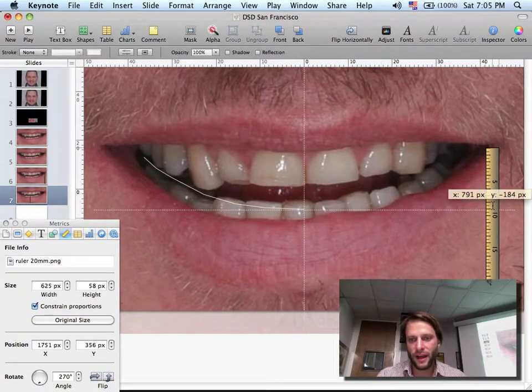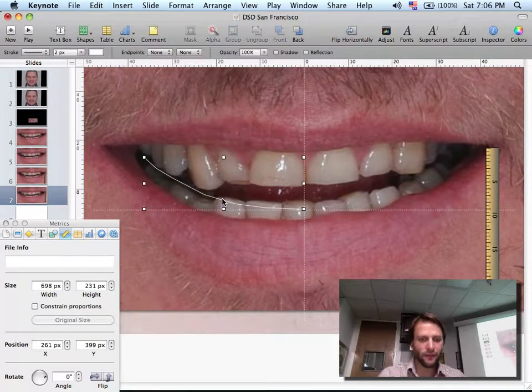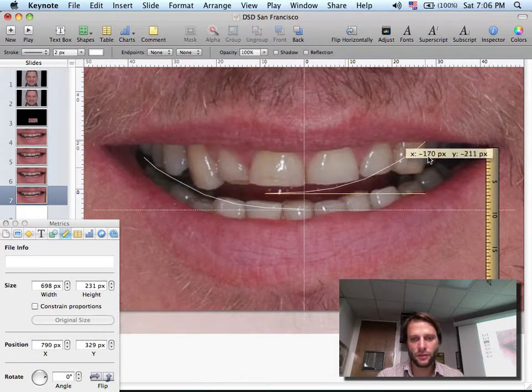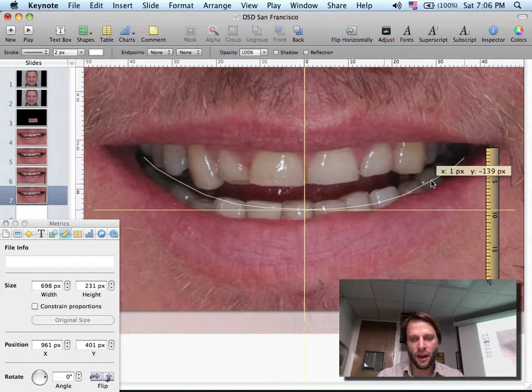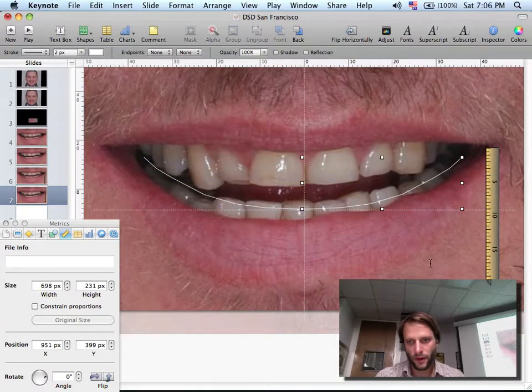So if I'm happy with that, what I'm going to do is to click on this half curve and Command D to duplicate. Oops, I'm sorry. Click on the half curve and do a Command D to duplicate this half curve, and then I'm going to flip this curve horizontally. Once I flip it horizontally, I will drag it to the other side, and again the yellow lines will help me to position. So you will see these yellow lines.